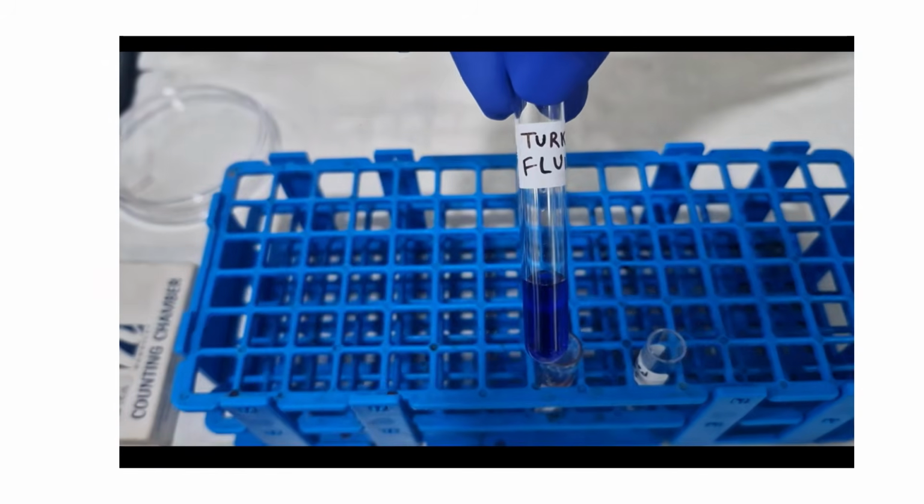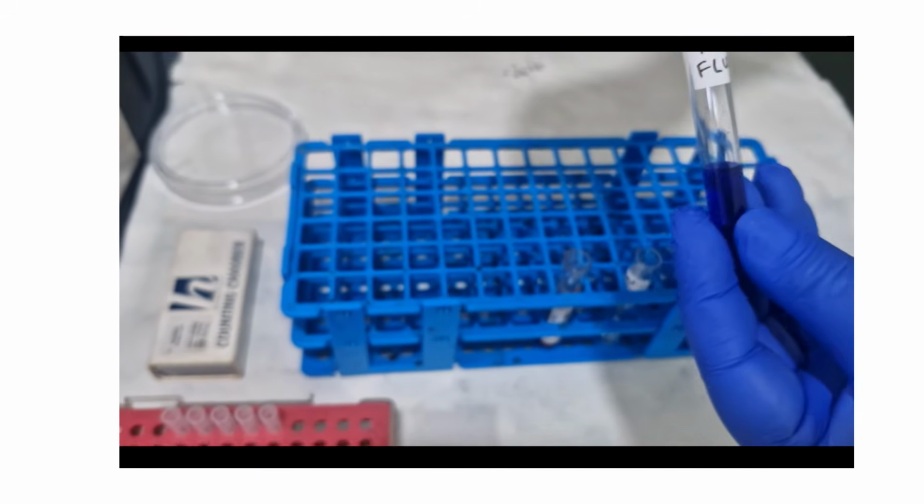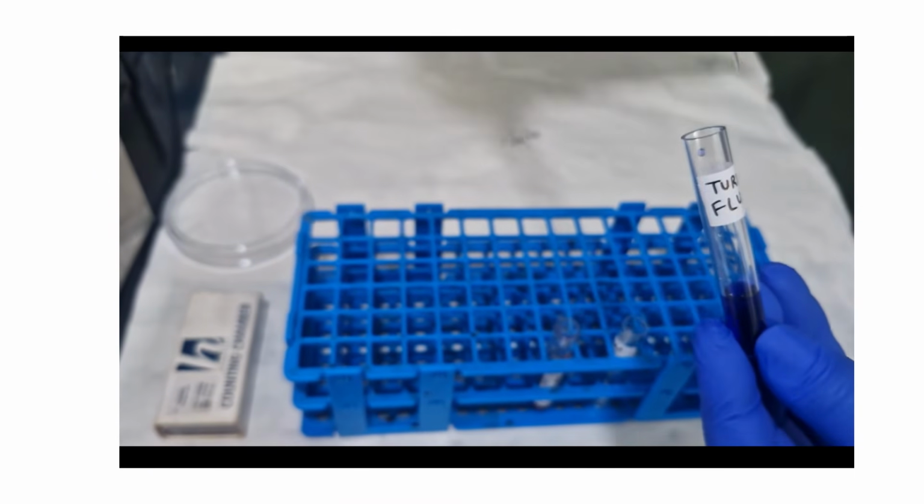Next, we will pipette 320 microliters of Turk's fluid in a clean test tube.